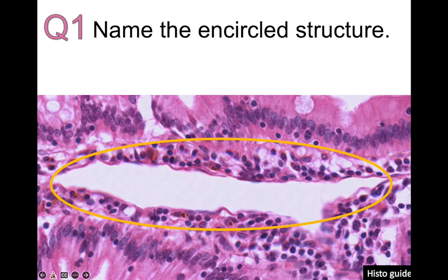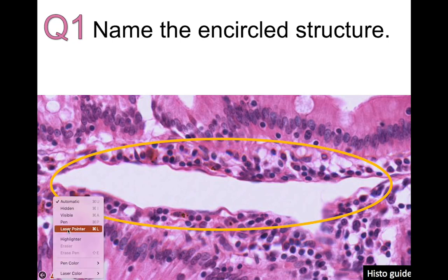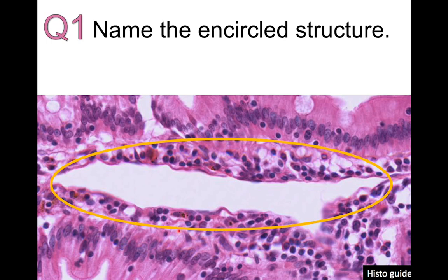Here we have a section of a vessel. When we see the lumen, it's irregular, so it looks like a vein, but it's not a vein. If it was a vein, veins have 3 tunics or 3 layers. Or you might think it's a venule. As you know, venules have an endothelium and connective tissue, but it's too large to be a venule. Venules are not this large.